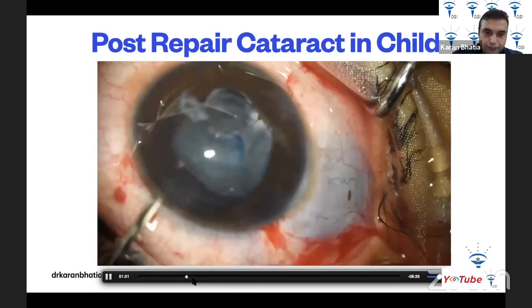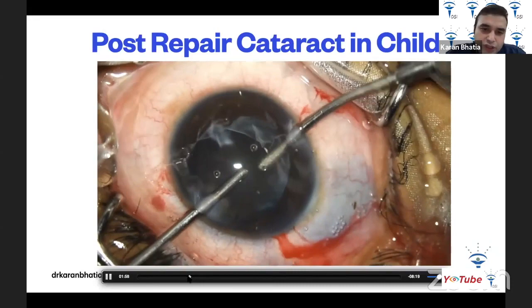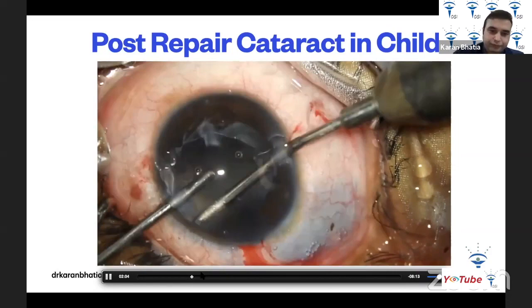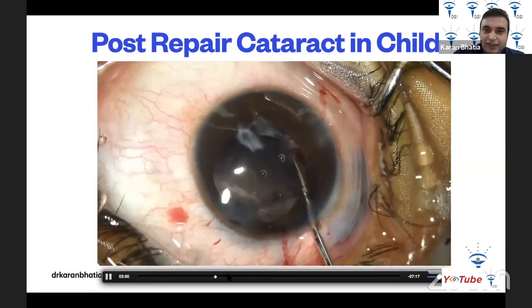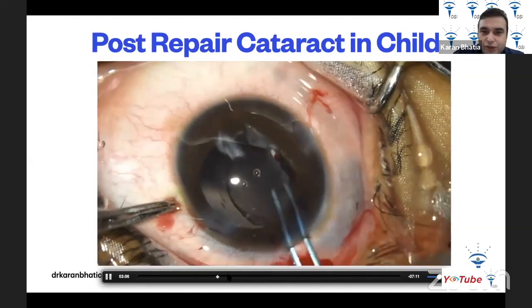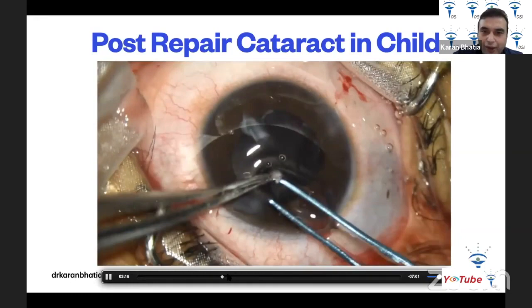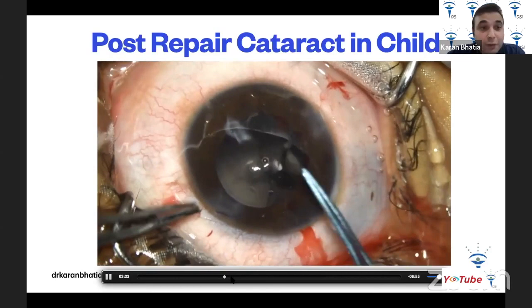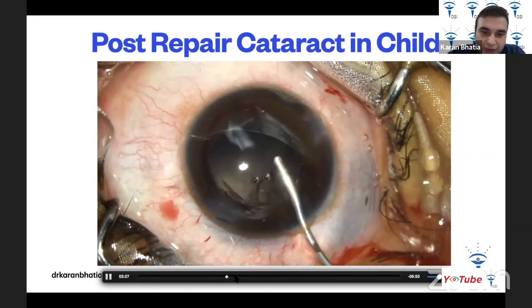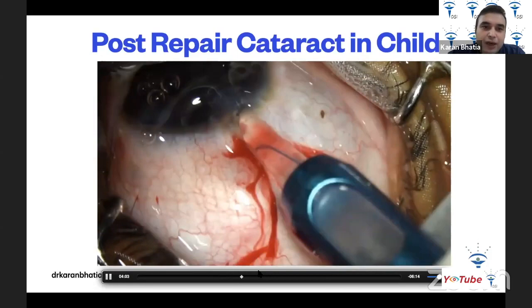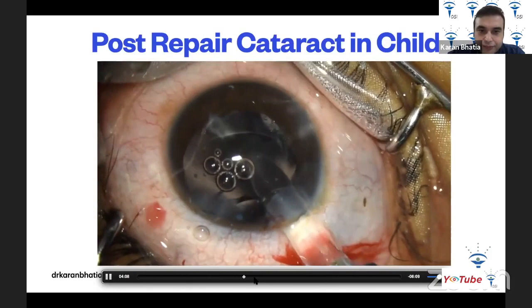The loose fibrotic piece is brought out of the eye. Bimanual irrigation-aspiration removes the lens matter, which comes out very easily given how soft it is. Some synechiae are released, and a second plaque is found — very common post-trauma, particularly in children. The plaque is peeled off with micro rhexis forceps; if it won't peel, it must be removed with a cutter. After washing and injecting OVD, a three-piece foldable lens is implanted into the bag.